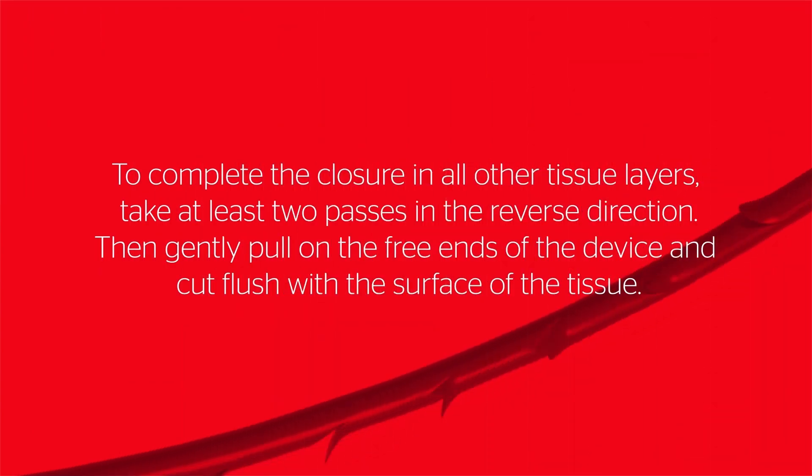To complete the closure in all other tissue layers, take at least two passes in the reverse direction, then gently pull on the free ends of the device and cut flush with the surface of the tissue.